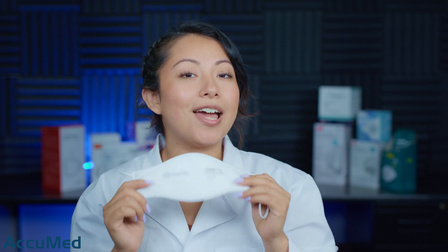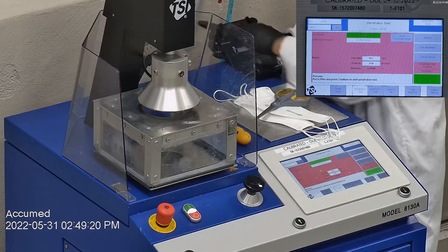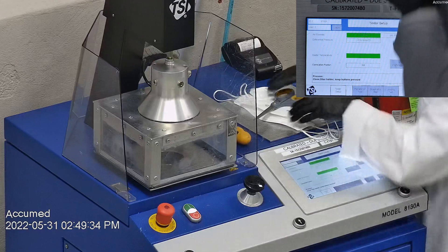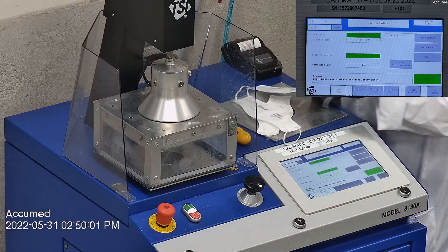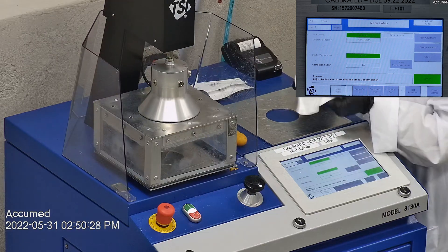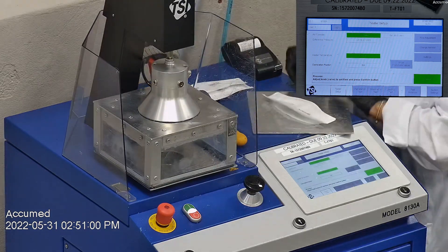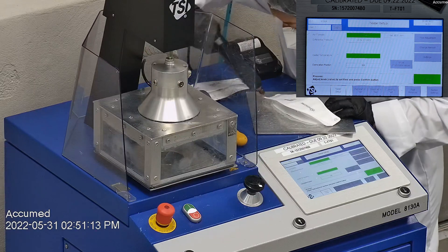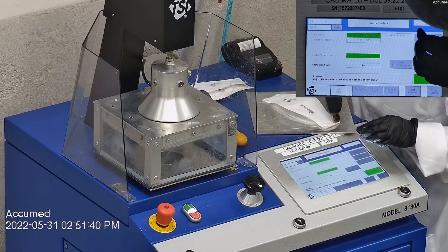Let's go ahead and see how these test on our TSI machine. We're going to be testing both the filtration and the pressure drop. This is our TSI machine model 8130A, which is the same filtration testing machine that NIOSH uses to approve N95 respirators. Our procedure is inspired by NIOSH — we first run a tester setup and start removing the ear loop bands from the mask before placing it onto a testing plate to ensure a proper seal. We make sure the mask is completely sealed with hot glue, with no holes or leakage, to ensure accurate results.